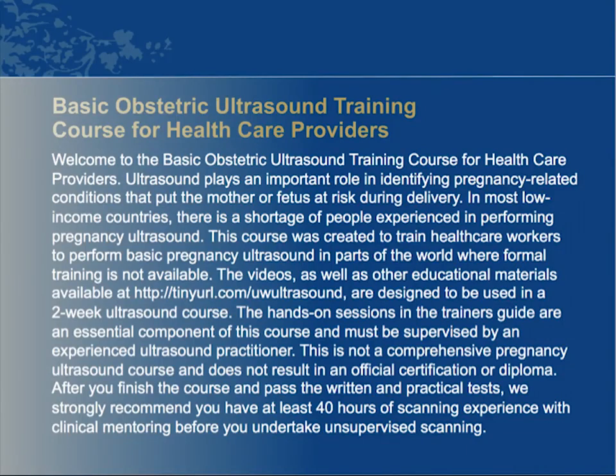Welcome to the Basic Obstetric Ultrasound Training course for healthcare providers. Ultrasound plays an important role in identifying pregnancy-related conditions that put the mother or fetus at risk during delivery. In most low-income countries, there is a shortage of people experienced in performing pregnancy ultrasound.